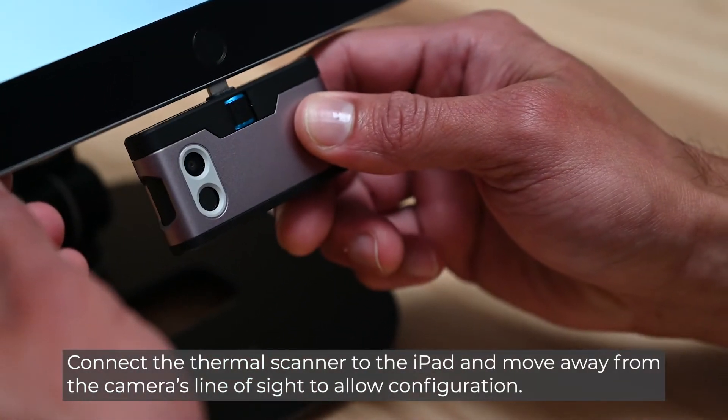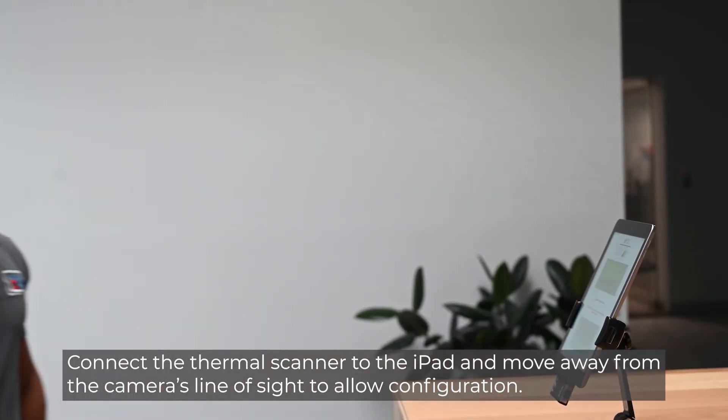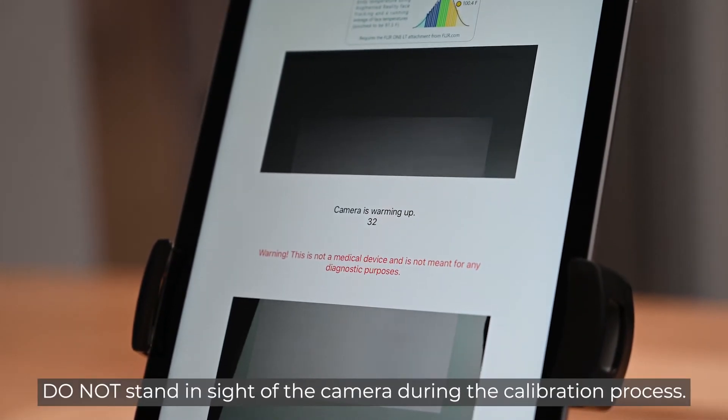Connect the thermal scanner to the iPad and move away from the camera's line of sight to allow configuration. Wait 60 seconds for the scanner to calibrate. Do not stand in front of the camera during the calibration process.